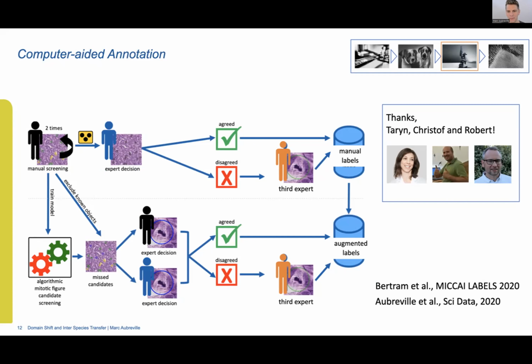So just briefly, how did we make sure to keep down the labeling noise? Because mitosis is something that is very prone to labeling noise. We had one pathologist looking for true positives, or real mitotic figures, and also some non-mitotic figures, something that looks very similar. We handed this over class-blinded to a secondary expert, and if both experts agreed, then we added this as a positive label. If they disagreed, then we had a 3rd expert rate. So we always have a majority of 3 experts, because if 2 already agree, then the 3rd doesn't need to be asked, of course.